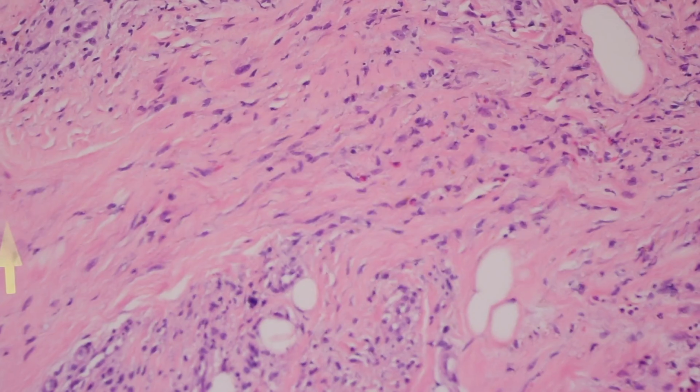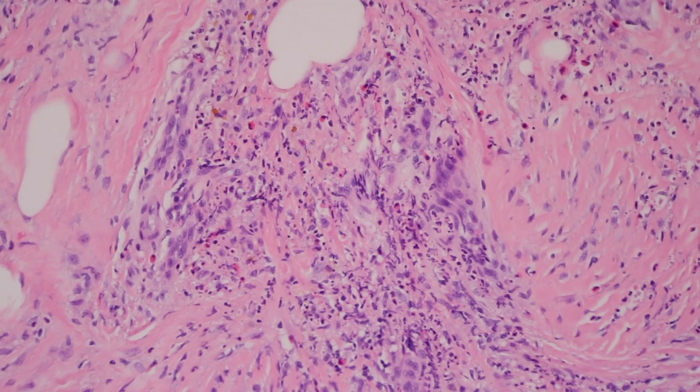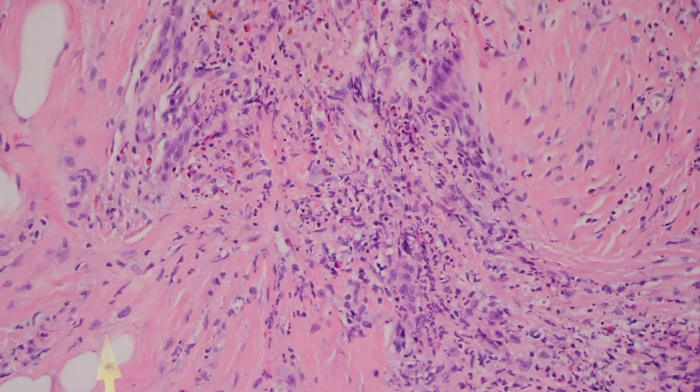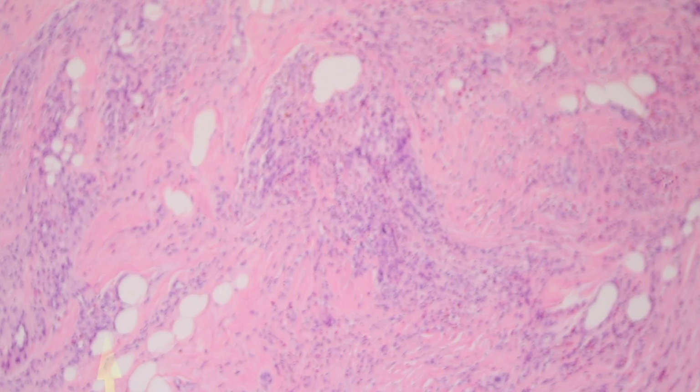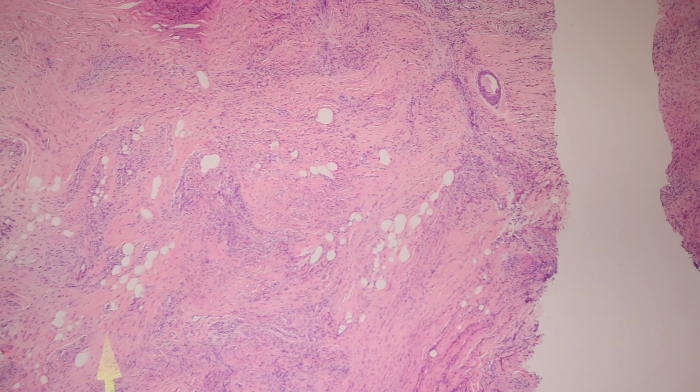And again, just like in granuloma faciale, the eosinophils are present, scattered around, and again, you can see there's some neutrophils here and some nuclear debris as well. So it's like a subtle LCV that's burned out and left behind an enormous amount of background sclerosis and collagen deposition that's basically filling up the dermis and down into the subcutis. And so that's why it makes these nodules that are seen clinically.